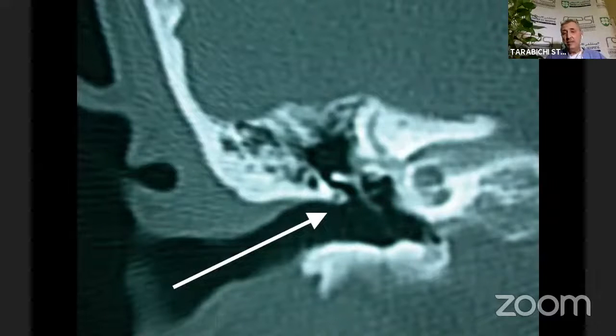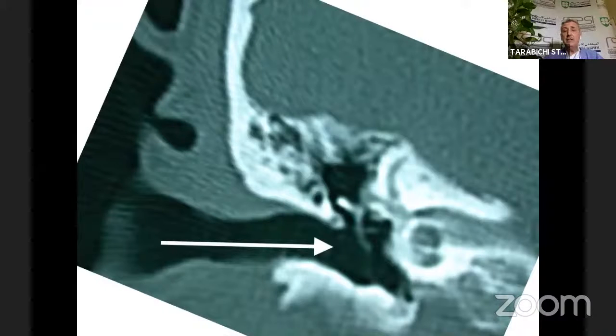This is something that I mention constantly because it really makes a huge difference. And this is a natural orientation. This is, of course, a coronal view. This is a natural orientation of the ear canal being upsloping. So again, one of the great advantages of the endoscope is the ability just to turn the endoscope this way and get a very, very different view. So you really don't want to start like this. You want to start at a right angle. So it really is very important to bring the ear canal into a right angle.